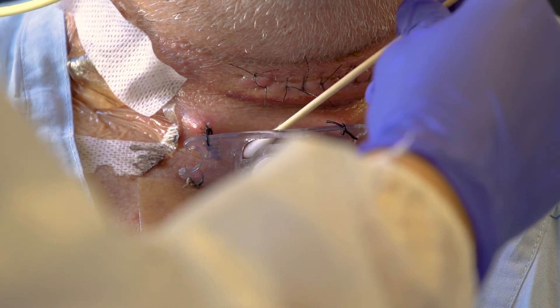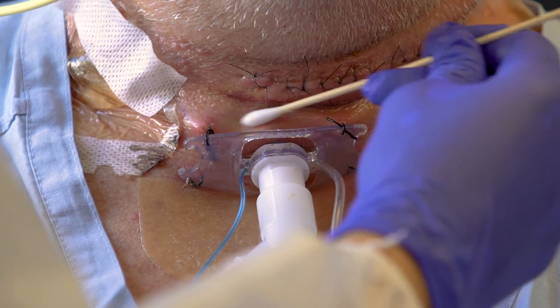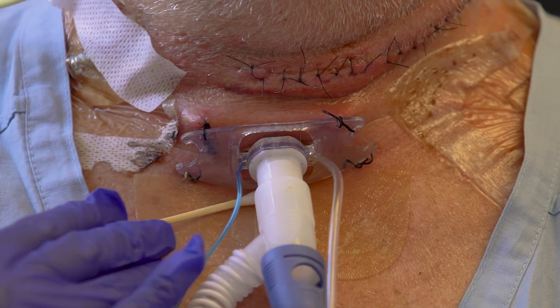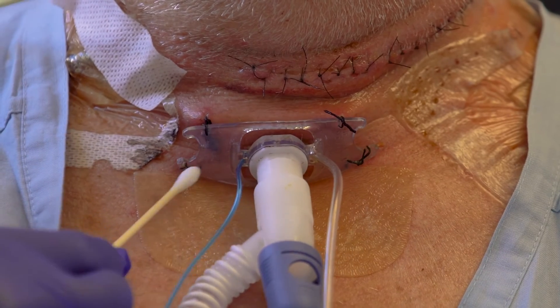Clean the stoma with normal saline soaked swabs. This should be done at least once a shift or more frequently if indicated.